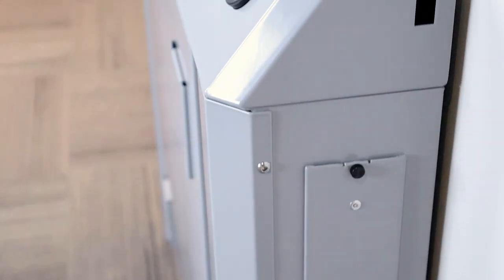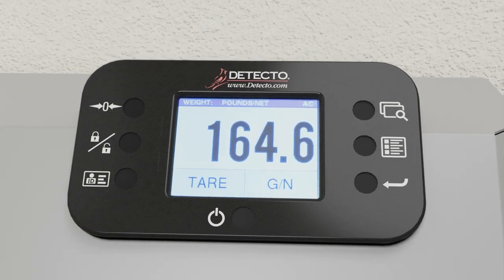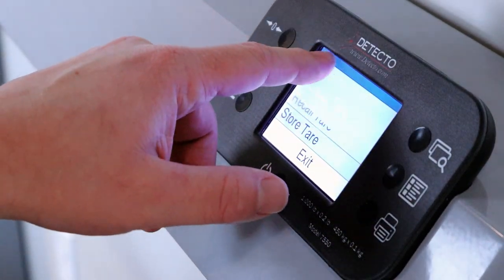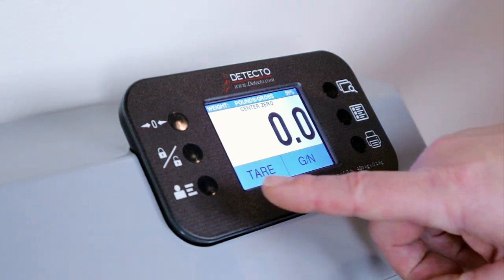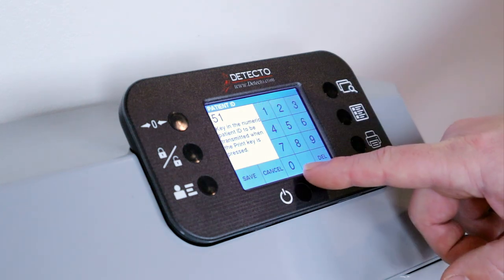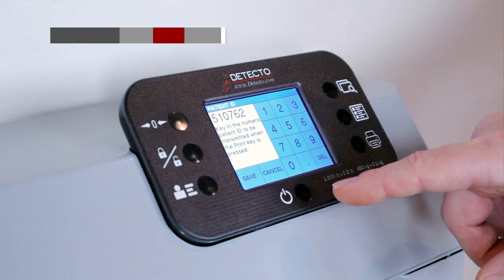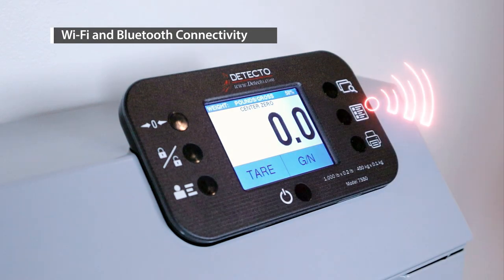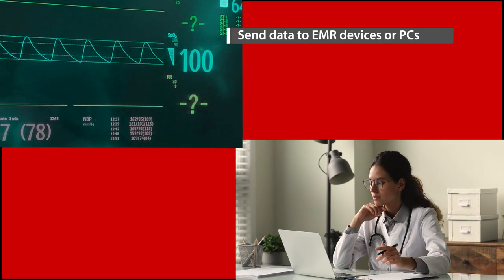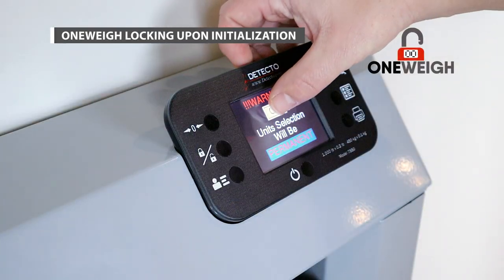The 7550 uses Detecto's state-of-the-art 855 indicator that is the size of an iPhone and integrated into the top panel of the scale. The full-color touchscreen LCD with wheelchair tare weight mode allows you to remove wheelchair weights and factor patient weights easily. The touchscreen allows you to easily key in patient IDs that can be sent to EMR software for recording patient records, and the scale comes with Bluetooth 5.0 and Wi-Fi standard for wireless connectivity. OneWeigh units locking sets the weight into pounds or kilograms upon initialization.